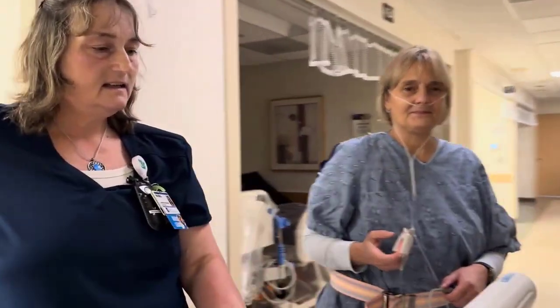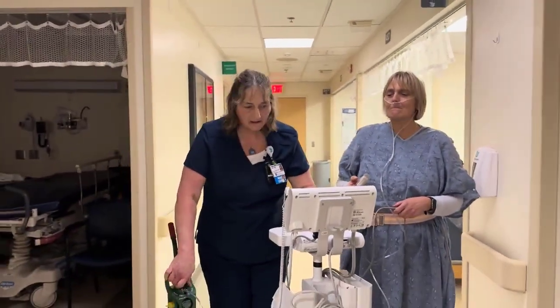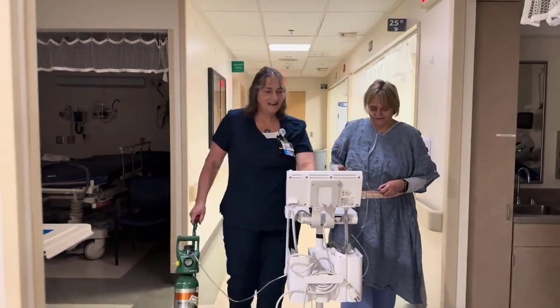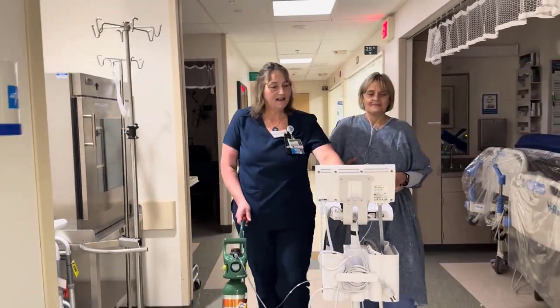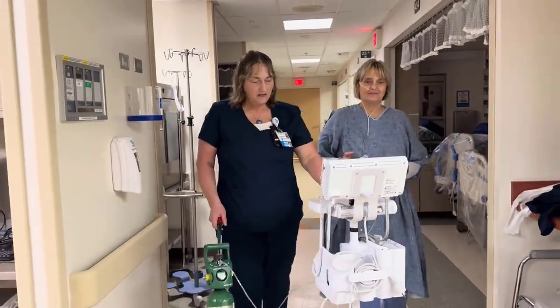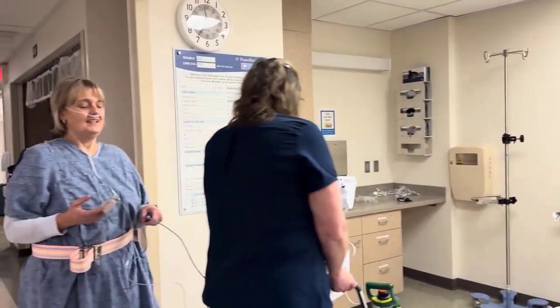All right. Good, her stats are coming up. Okay. She's still below 88%. So I'm going to turn her up another liter here. You doing okay? Mm-hmm. All right. And perfect. 2 liters, she got above 88% again, and that's perfect. So now we're back up a bit above 90 now. So, okay, let's go back into the room, back to the bed. You doing okay? Yes, I am.